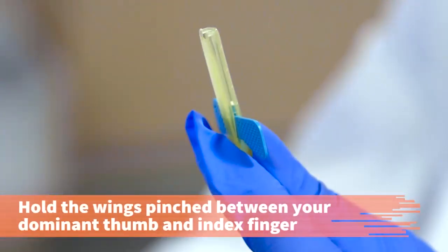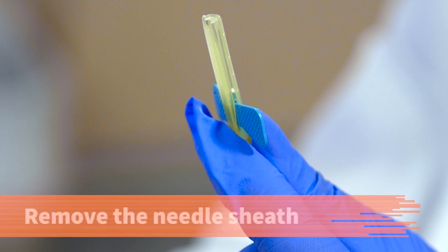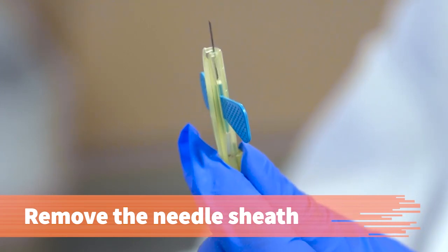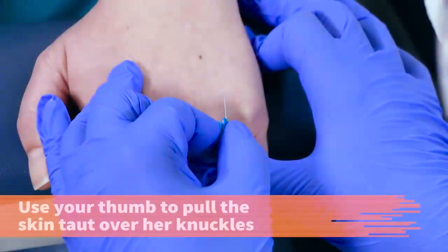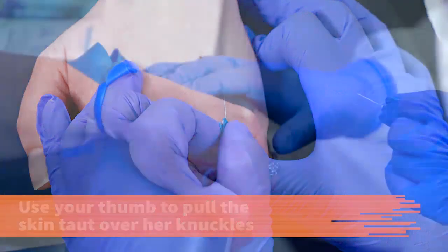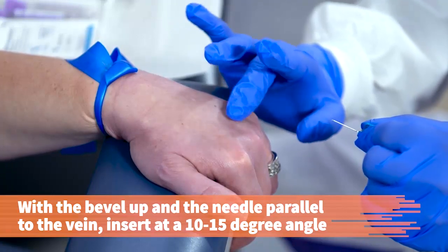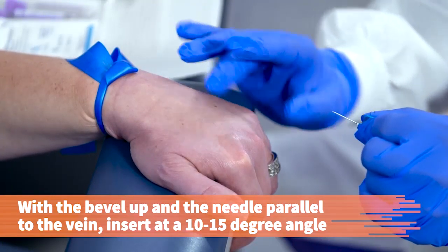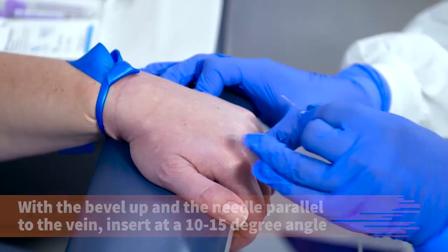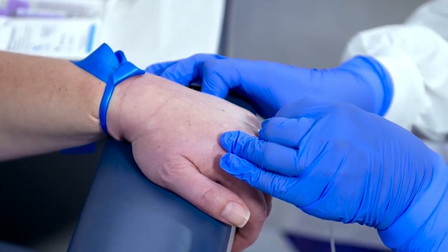Reapply the tourniquet when the alcohol is dry. Hold the butterfly wings pinched in between the thumb of your dominant hand and index finger, or hold the base of the needle. Remove the needle sheath. Use your thumb to pull the patient's skin taut over her knuckles. With the bevel up and the needle aligned parallel to the vein, insert the needle at a 10 to 15 degree angle through the skin and into the vein with a quick but smooth motion.